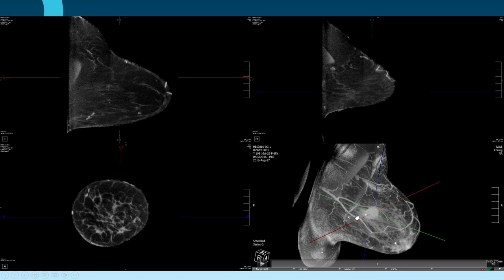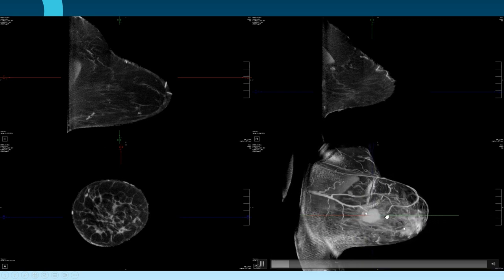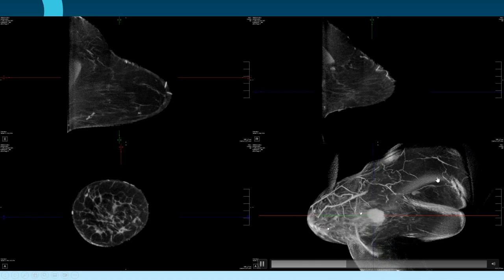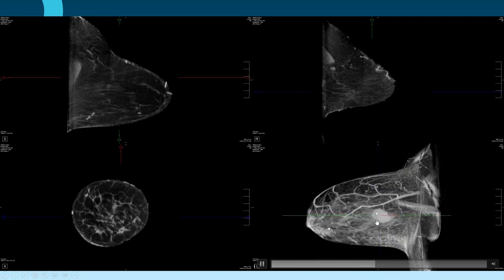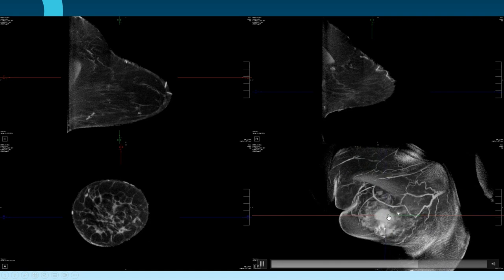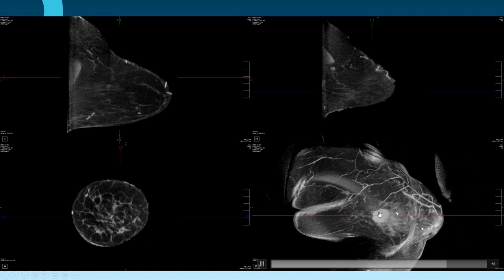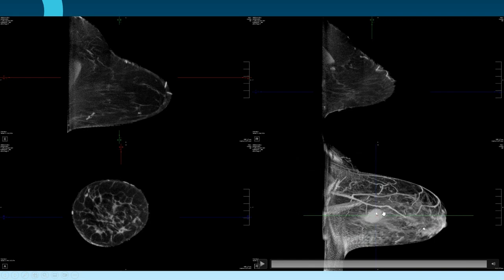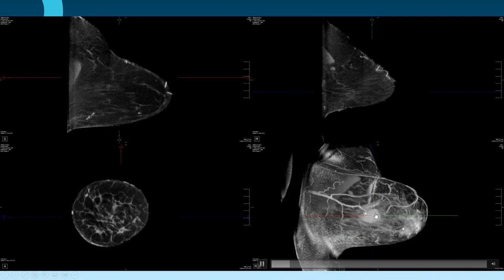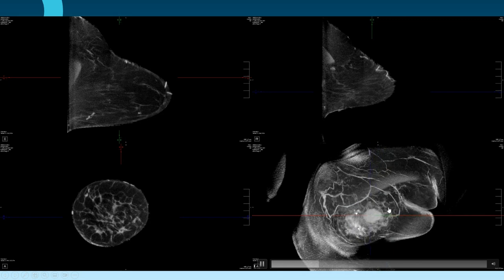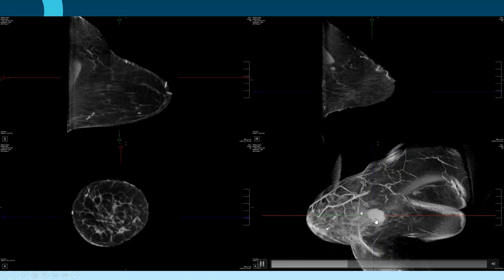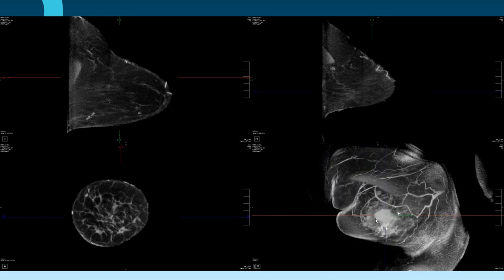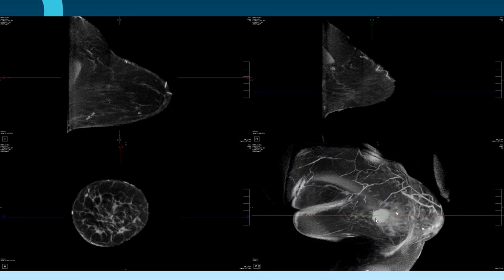When you show the 3D reconstruct to a patient, they can understand better what's in their breast. If you show it to a surgeon, they have a better idea of how to plan their surgery. There are so many benefits from this 3D reconstruct. These are the standard four images displayed from that one 10-second acquisition, and then we can manipulate them every which way.